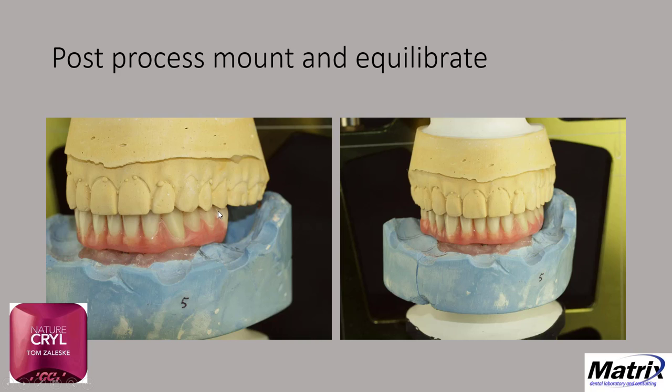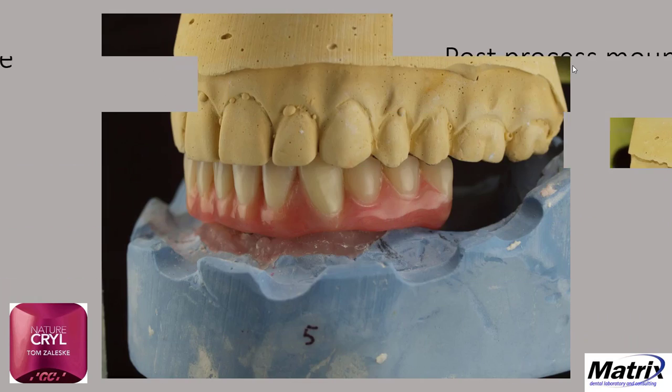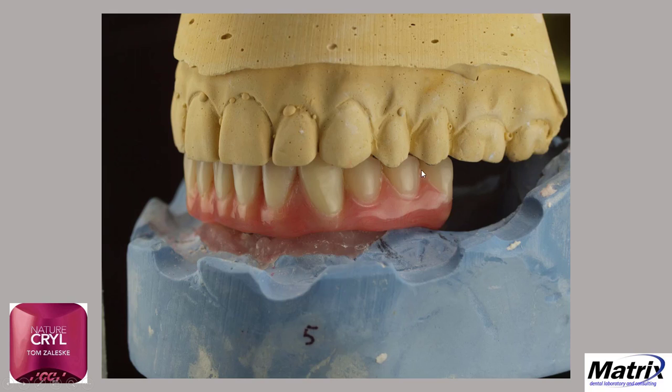I'll show you what I did, but I did convince the doctor to cut the molar in half to eliminate a bit of the cantilever. He wouldn't allow me to do it on the other side, but on this side he allowed me to make that about the width of a bicuspid. So it's almost like we have 3 bicuspids. So what? We took off about half a tooth. I'm hoping that is going to help the case along.